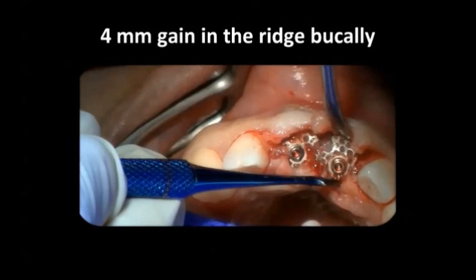You see how much gain of bone we got. We get a big amount of bone on the buccal side. If you measure, it's more than 2 millimeters on the buccal side. This is one of the key factors we discussed, that we have to have at least 2 millimeters. This is more than 2 millimeters, so we are safe in this kind of case. The implant is positioned in the proper site, which is the cingulum area. We have a good buccal bone, and we saved the papilla.